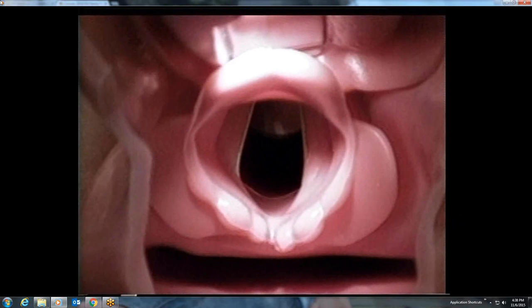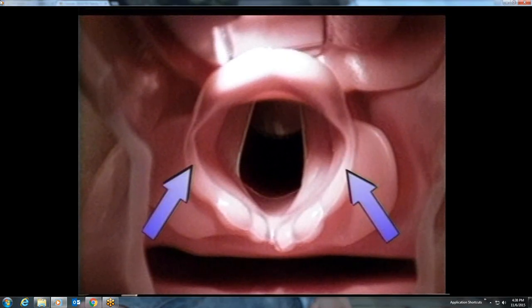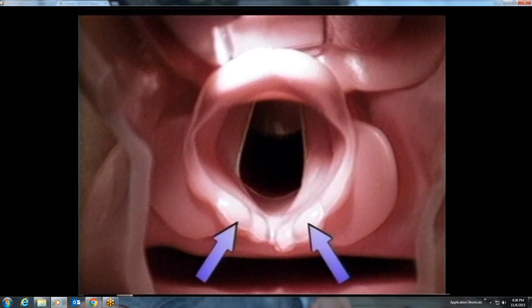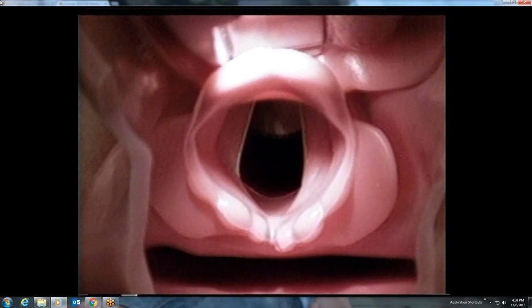On this model, note the following structures at the top of the larynx, as shown with the curved blade with the tip placed in the vallecula at the base of the tongue: the tip of the epiglottis, the aryepiglottic folds coming down on each side, the paired cuneiform tubercles, the paired corniculate tubercles, and the interarytenoid notch. The cuneiform and corniculate tubercles are commonly called the arytenoid cartilages, although they are anatomically separate structures. In this video, we will refer to them as the posterior cartilages.